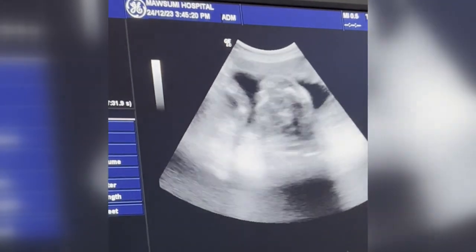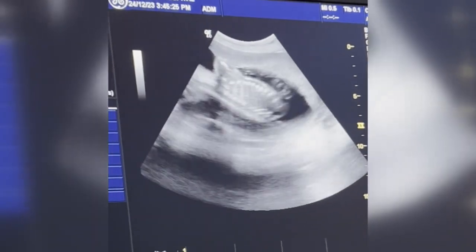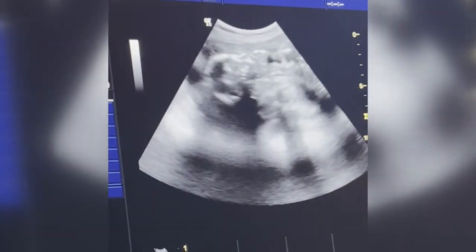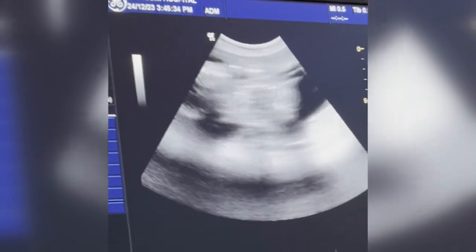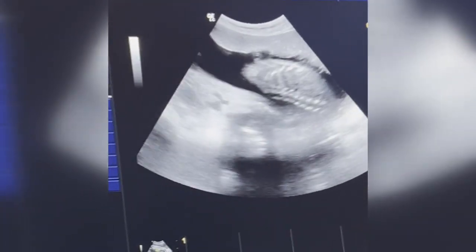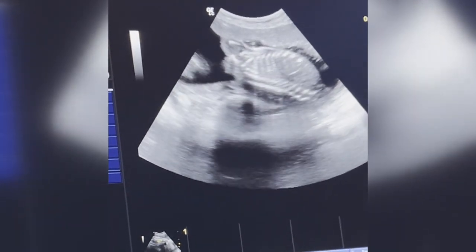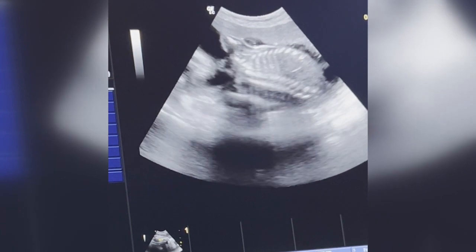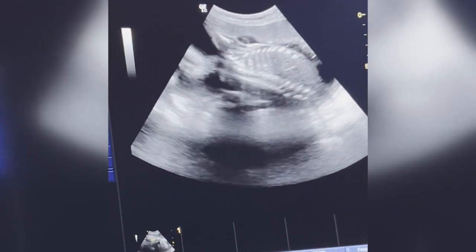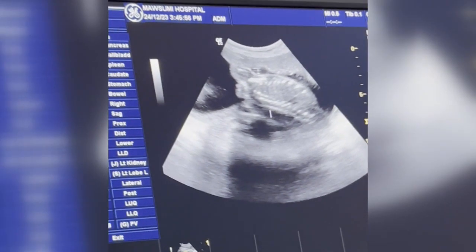Now I shall go for spinal cord. You have to have a little patience. Spinal cord. It is spinal cord, and see the railroad appearance. There should be a railroad appearance. Spinal cord. Spine. I'm writing here. Spine.